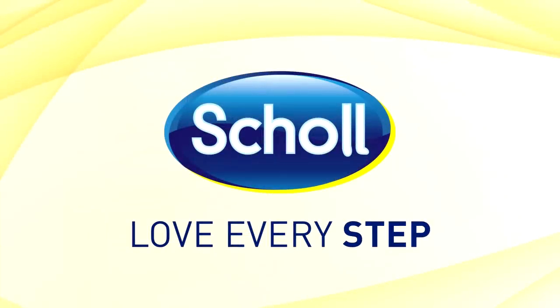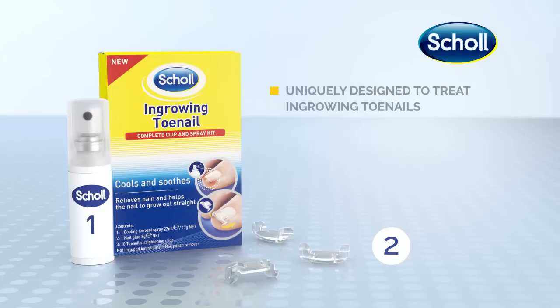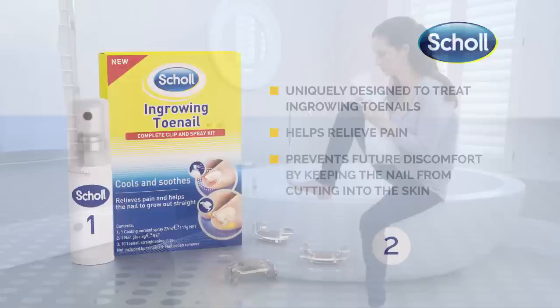At the first signs of discomfort, recommend Shoal Ingrowing Toenail Complete Clip & Spray Kit to relieve pain by keeping the nail from cutting into the skin and helping the nail to grow out straight. Here is how to use our do-it-yourself kit for your patients.